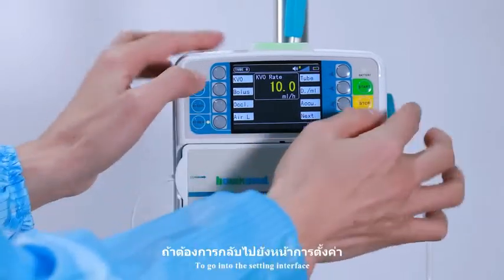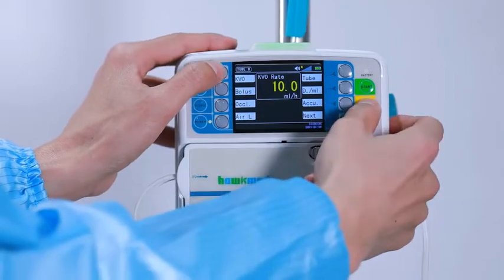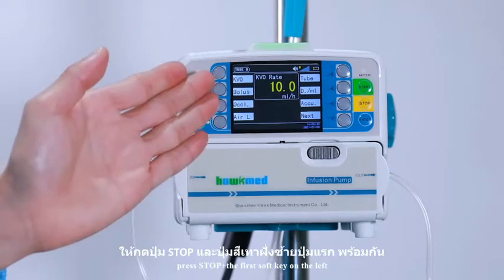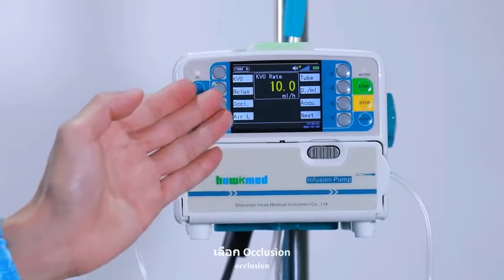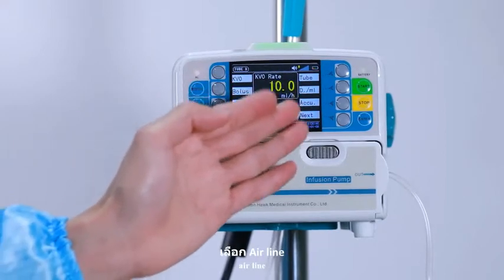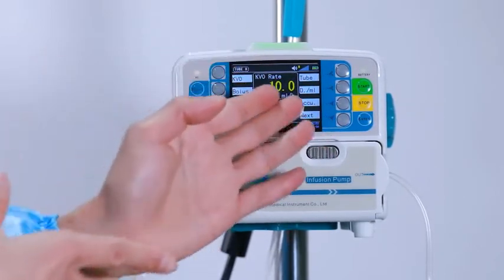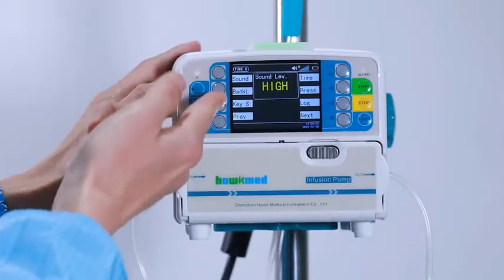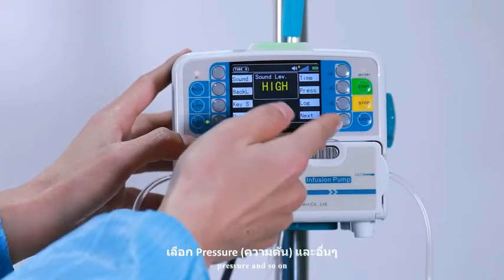To go into the setting interface, press stop plus the first soft key on the left. The settings include: KVO, bolus, occlusion, air-in-line, tube brand, accuracy, sound, backlight, key sound, pressure, and so on.